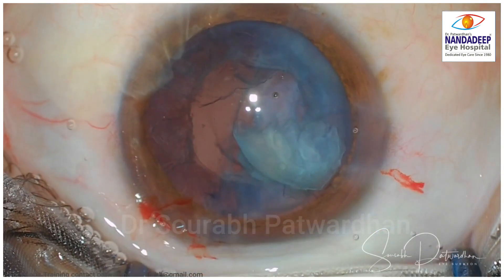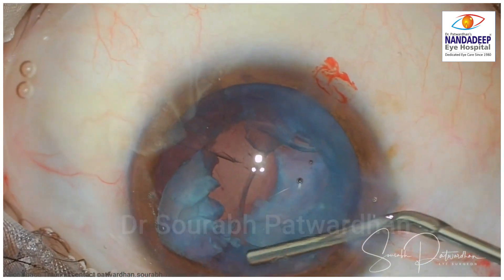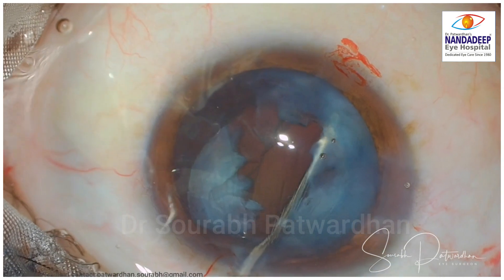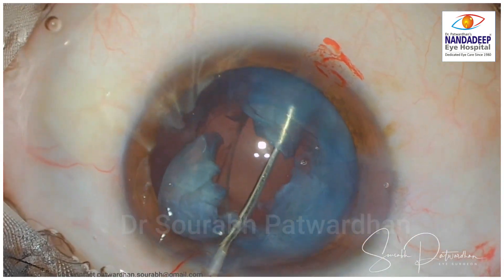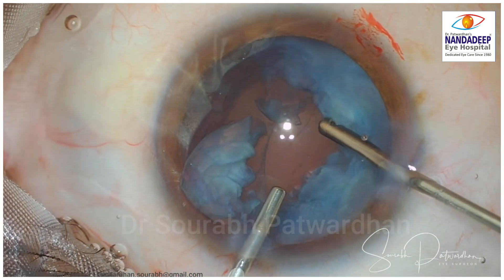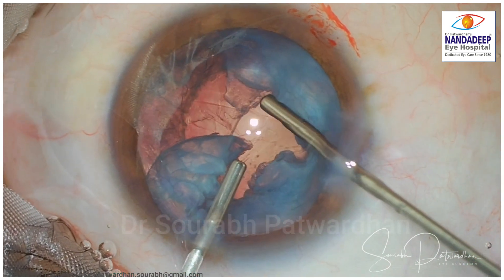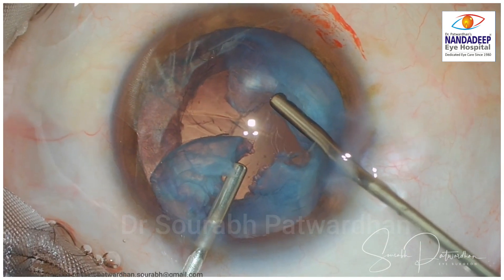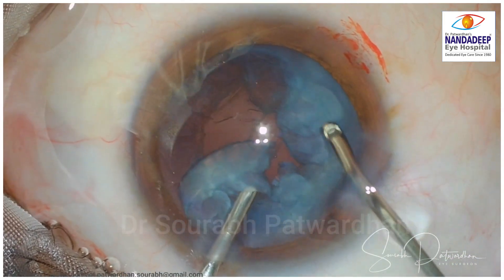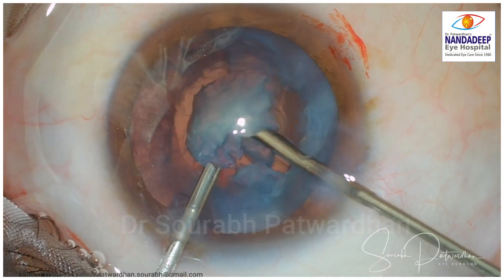There is already some nucleus matter remaining and you can see a small chunk which is behind the posterior capsule. That is a concern because I don't want that soft part of the cataract to drop down — it may need vitrectomy otherwise. After replenishing the viscoelastic in the back with the Sinski, I nudge this small nucleus piece into the anterior chamber. I then enter with the vitrectomy probe through the main incision. The idea is not to make the chamber deep before taking out this piece which is trying to go into the vitreous.